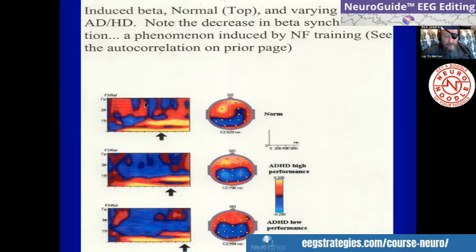So about 500 milliseconds later, the brain responds to that signal by turning on beta at the F3 location, because you have to hit the button with your right index finger. Their button push happened at about 700 milliseconds. So there's 500 milliseconds for conscious awareness, and another couple hundred milliseconds for your reaction time. And this is normal. But you also have bursts of gamma, 1, 2, 3, 4, 5, number 6.